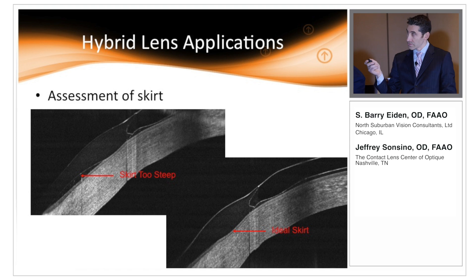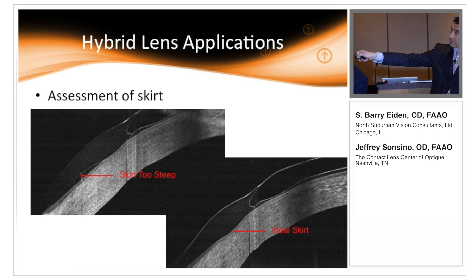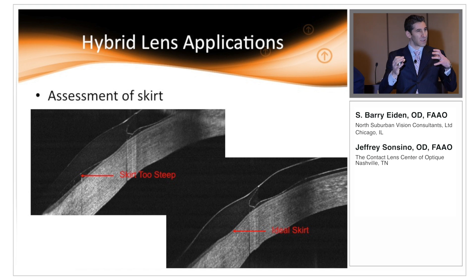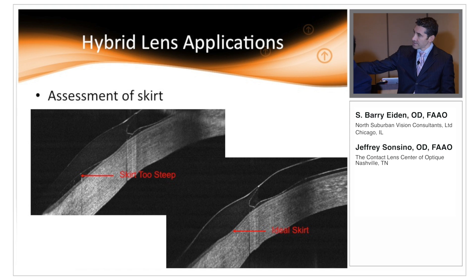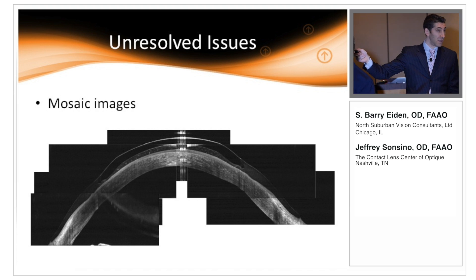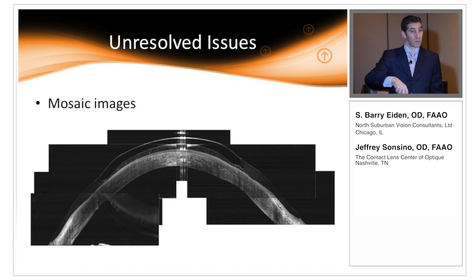We can also use OCT to assess the skirt alignment. On the left, we have a skirt that is too steep — there's a lot of space behind it, meaning it's not aligning with the sclera well. When we flatten the skirt, you can see it gently rides right on the sclera and contours really well. Another use of anterior segment OCT is creating a full mosaic image of the lens on the eye. You take a series of line scans, export them, and in a PowerPoint you line them up like a puzzle to get a very good global view of that lens on the eye.